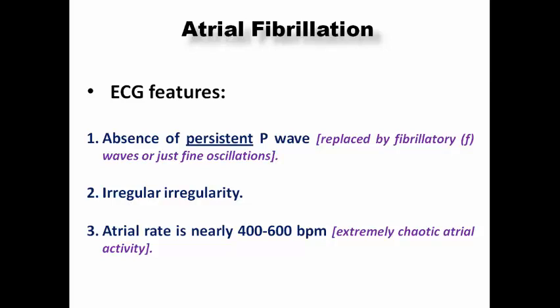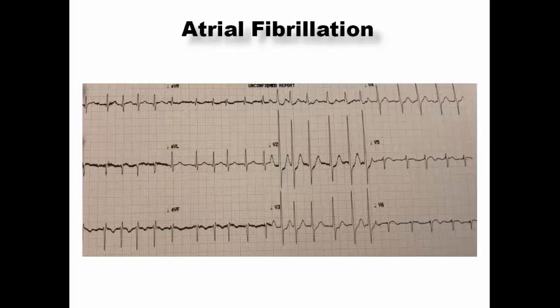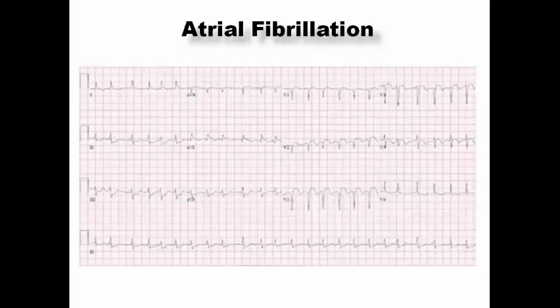In this ECG example, AF with rapid ventricular rate is present, with upsloping ST depression in V1 through V4 suggesting underlying myocardial ischemia or non-STEMI. In another example, the patient has AF — irregular irregularity with absence of persistent P waves — but also ST elevation in V1 through V4, representing anterior STEMI complicated by AF with rapid ventricular response.